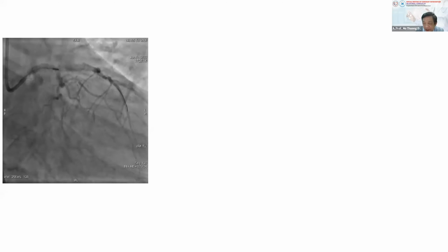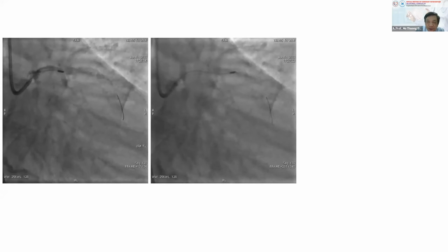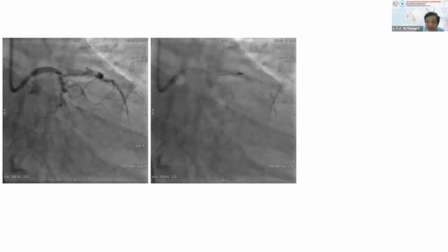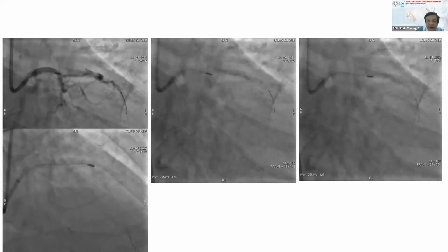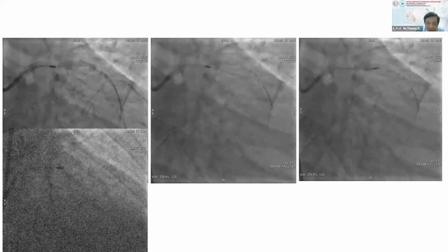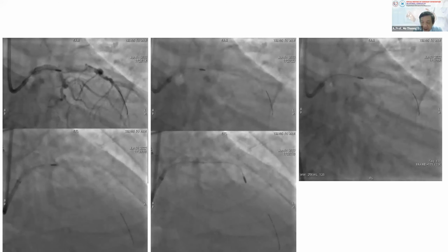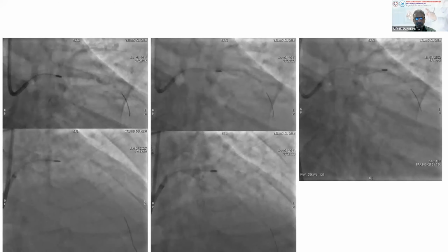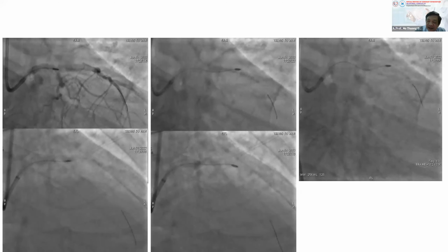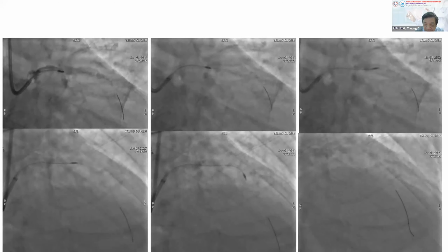And finally, I can bring the burr over the stent in the left main and into the ostium of the LAD. Okay, you see 1, 2, 3, 4 cannot pass. One more, 2, and in the third, successfully. It's a 1.25 burr. Yeah, 1.25. Only one burr. And after the burr crosses the region, the wire goes distal easily, because before it got stuck in the severe stenosis, and everything becomes easier.